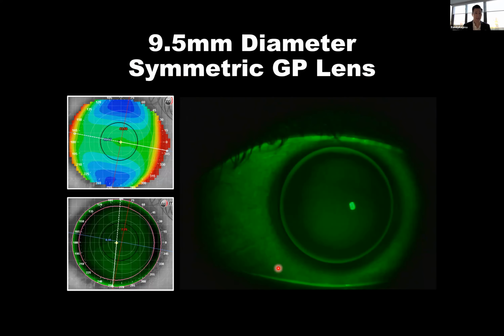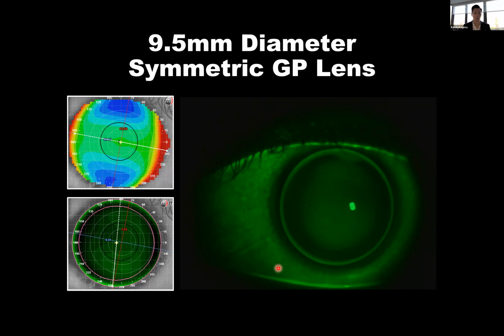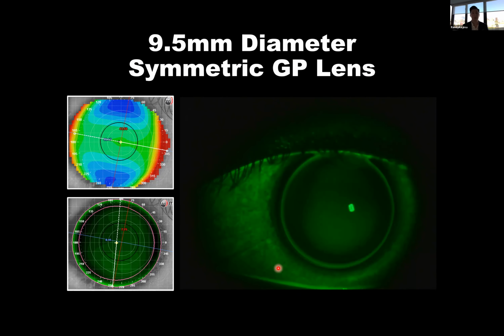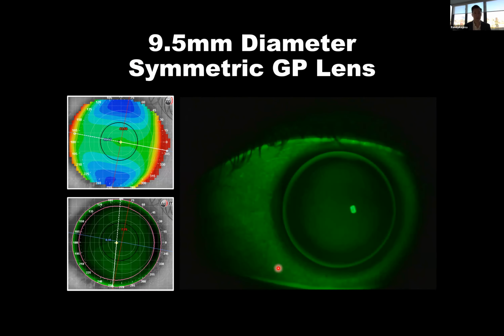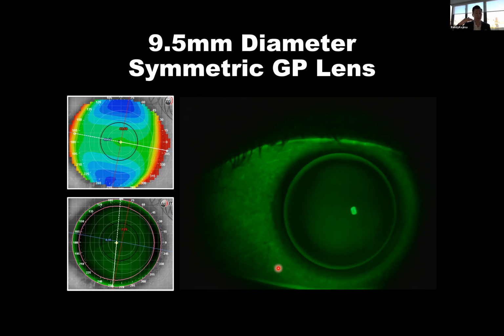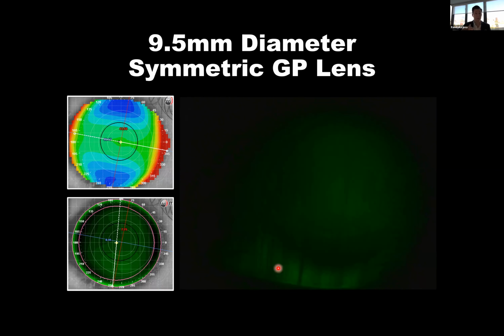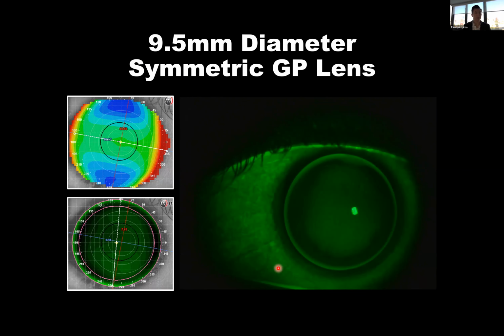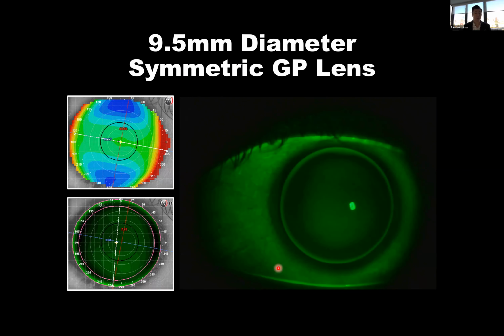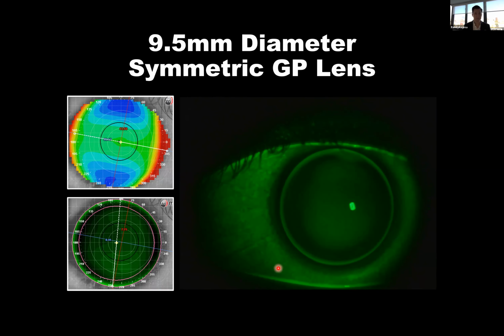So that's the same patient now wearing a bitoric corneal GP, and we can create a very good relationship for this cornea because it's such a symmetric eye and because it has two distinct axes 90 degrees apart, flat meridian horizontal, steep meridian vertical, the two 90 degrees apart. We build a toric landing lens, and of course we can create this ideal lens to surface relationship.